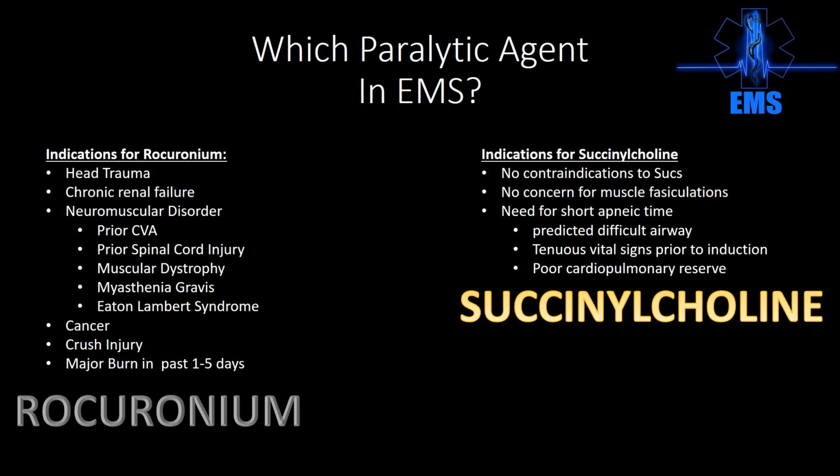I need to have reasonable success that I'm going to be able to accomplish this tube, i.e., the patient may still be a difficult airway, but I have figured out my plan, and I can successfully negotiate that plan, and I have got a plan for a backup and a backup. So we're already down the road of ET intubation, BIAD, and lastly, crike if this goes into a failed airway.